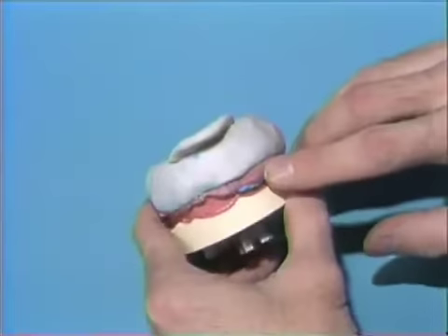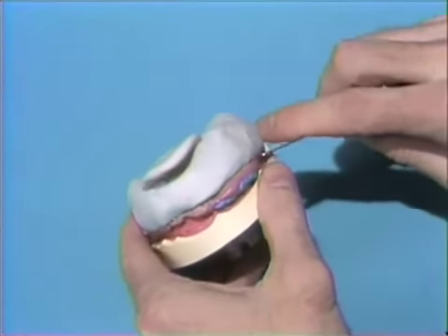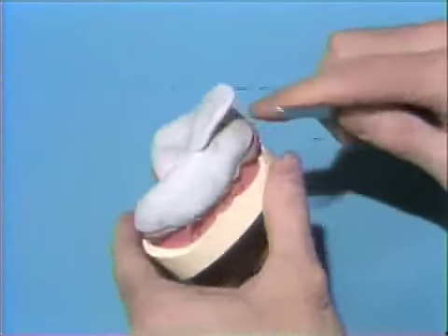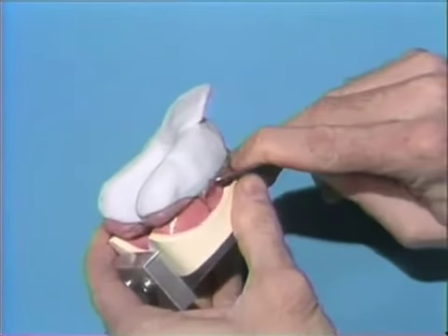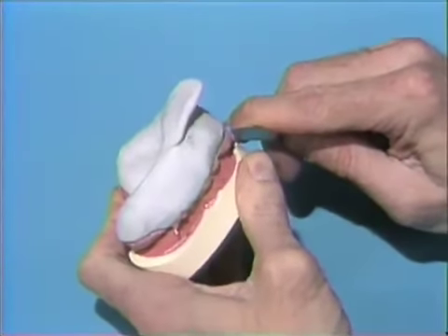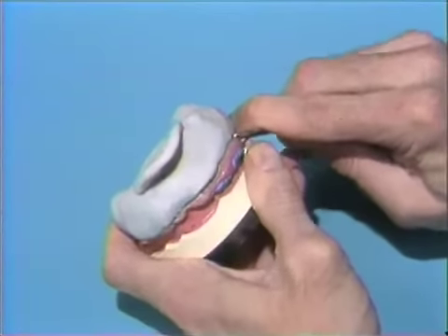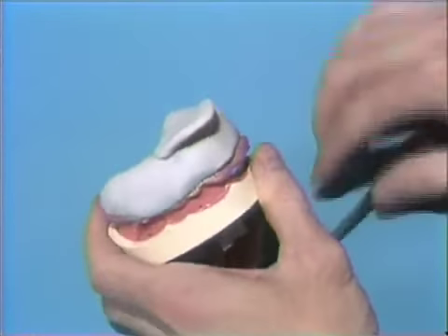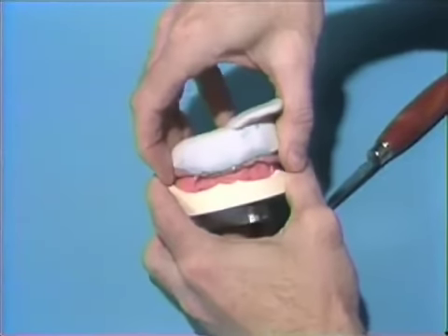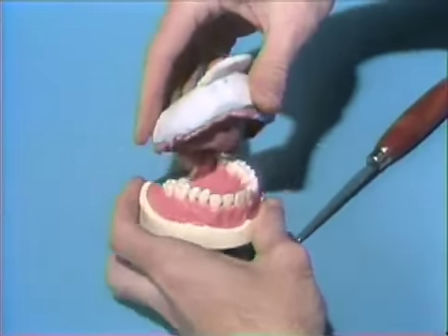Our impression material is now fully set. We've waited eight minutes from the time we started mixing it. We're ready to take the tray off. One good way is to try to lever it up lightly in the back areas to get it to release. Make sure you try to remove this tray in the long axis of the pins, since that's the area we don't want to break those preparations. We'll slowly work our way back and forth until the tray begins to come off.